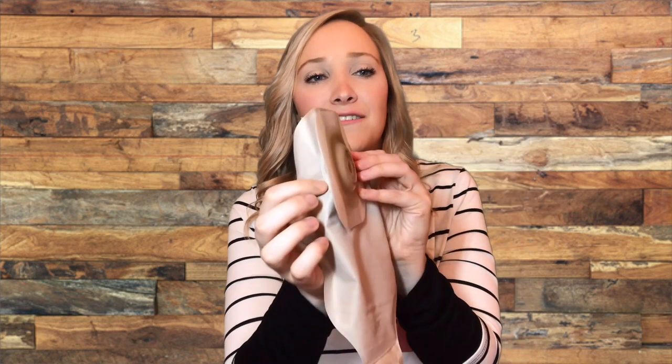This is a cut-to-fit bag — these lines indicate where you should cut to fit your stoma. If your stoma is 32 millimeters, there's a line that says 32 millimeters and you just cut to that line and put the system on. This is 8331. This is another one-piece option — it has convexity, is cut-to-fit, is a Lock and Roll drainable, and has a filter. This one cuts to fit up to 25 millimeters, while the other cuts to fit up to 64 millimeters. So when looking at different one-piece products, make sure you know the size of your stoma so you get one that cuts to fit up to that size. Or, once your stoma is the size it's probably going to be, you can start pre-ordering ones that are pre-cut.